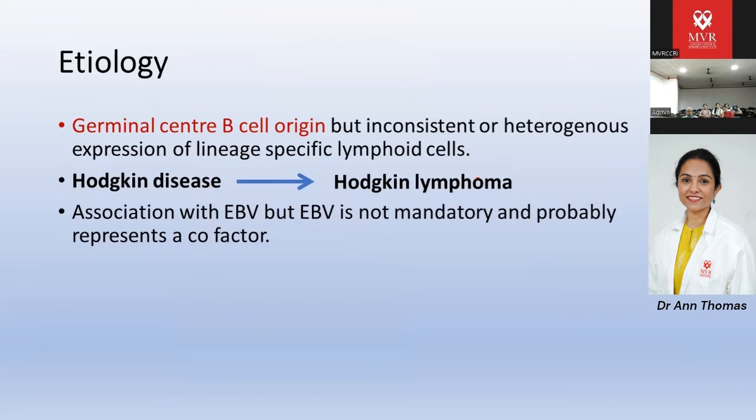We expect it to be positive for CD20, PAX5, and B cell transcription factors like OCT2 and BOB1. But despite being of B cell origin, the expression of these markers is inconsistent or heterogeneous. That will be more clear when I start showing you the slides of these individual cases.